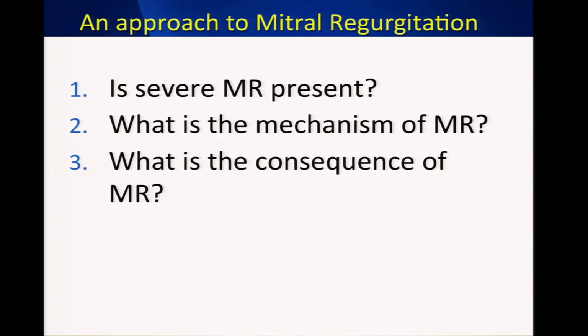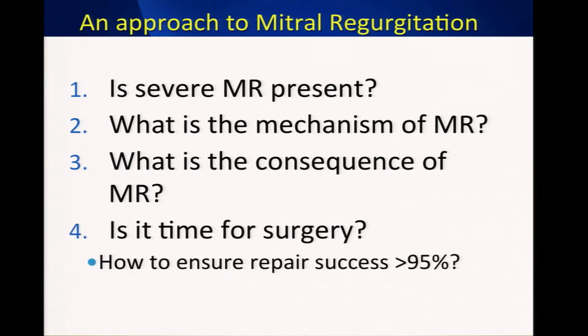And then, from the practical perspective, another question to be answered in this approach is, is it time for surgery? And what else can I say about this lesion to help people fix it? So where in this current era, are there features that would preclude a mitral clip application? Is it ideal for a mitral clip? Does it look like it's an isolated lesion where surgery should be reasonable? Is it a Barlow's valve that should only be approached for repair by the highest volume, best quality surgeon you have? So these are some of the issues.